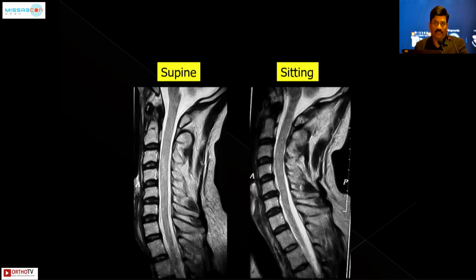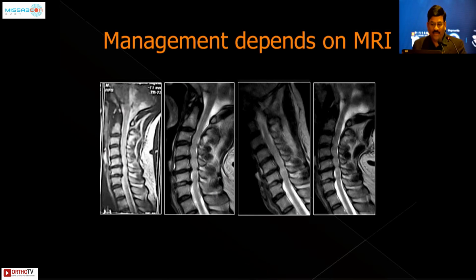But this is one of the few important things: this patient has supine significant radiculopathy not resolving with conservative treatment, but when we subject the patient to sitting, then we can identify the reason for the pain and you can suggest some treatment for this kind of patient population.